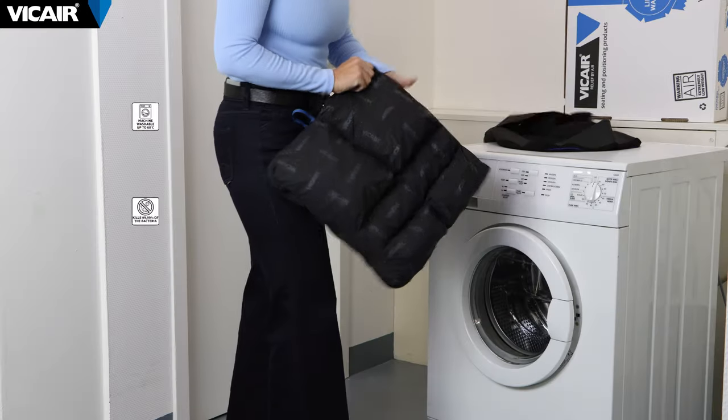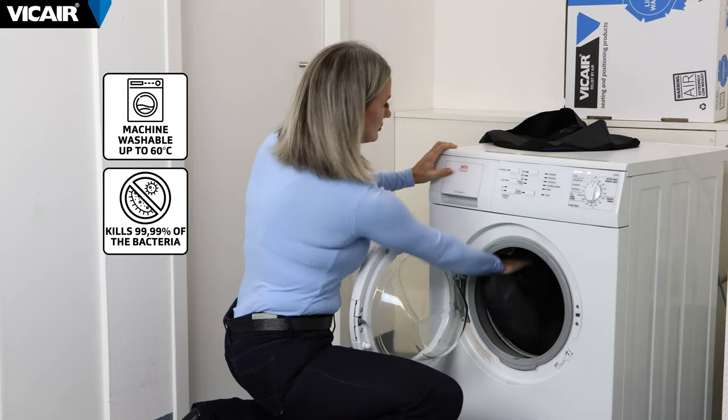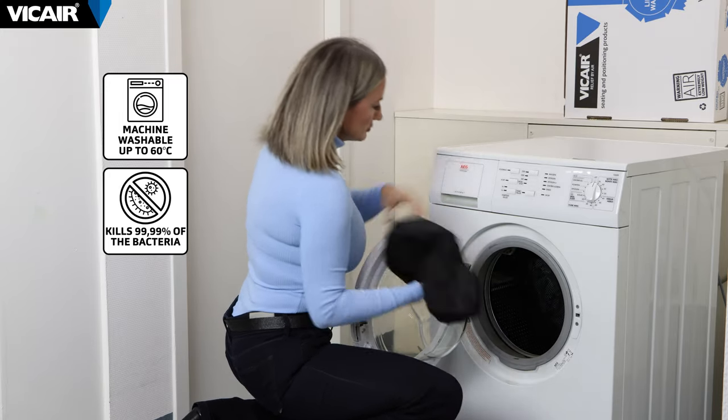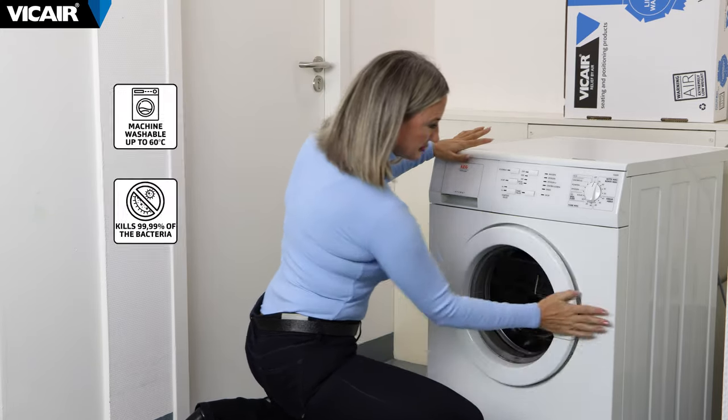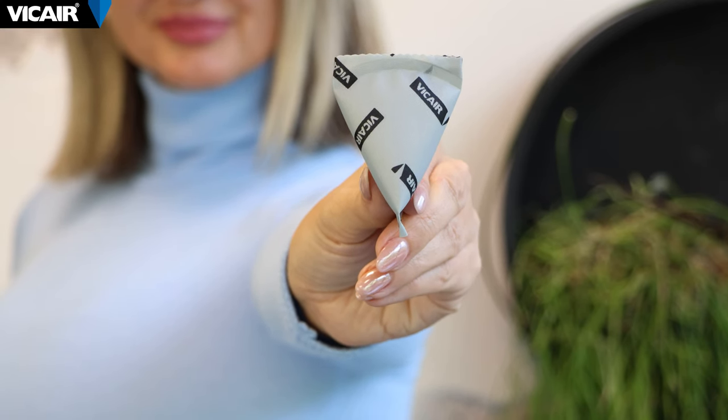The Adjuster O2 is easy to use — there's no pump and no additional equipment needed to utilize the cushion. Furthermore, it is machine washable in its entirety, with smart cells staying in their compartments so that the setup is maintained. The cushion is safe to use due to the hundreds of smart cells inside; even in the unlikely event that a cell fails, you're still protected.